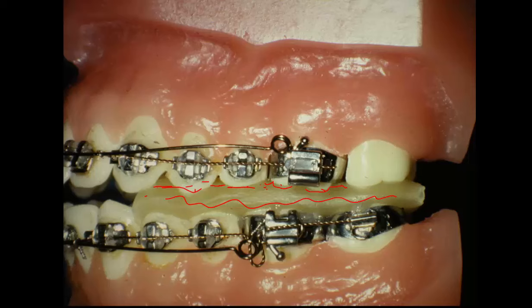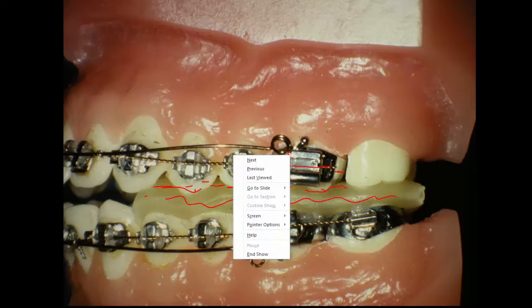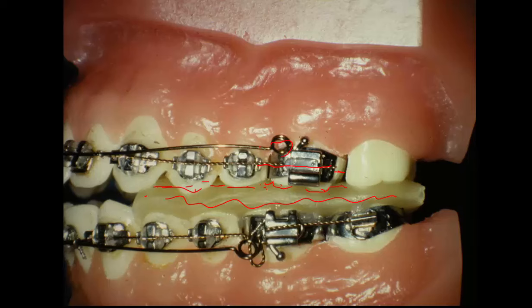Now, this is on a typodont. This is your conventional arch wire. This is your intruding wire right here. This is to open the bite, so this wire would go way up and come down on the other side. It's just brought down, hooking these teeth, starts raising them. This one would go down, brought up here, like it would go all the way down, and then you pull it up and tie it to these teeth to bring them down. And that's what we did on this guy, except I think the bottom was pretty well lined up.